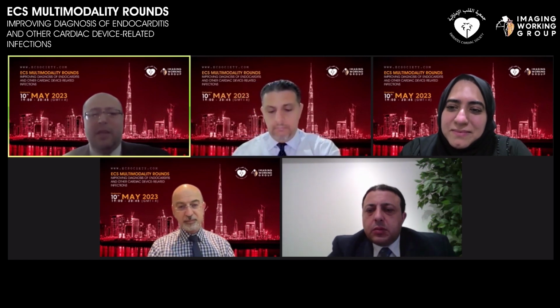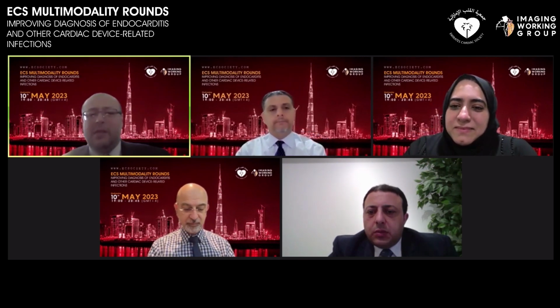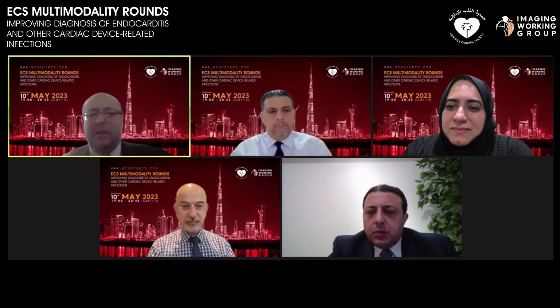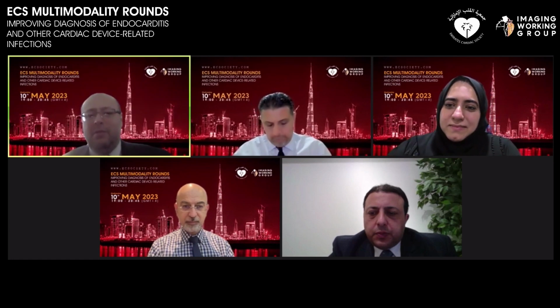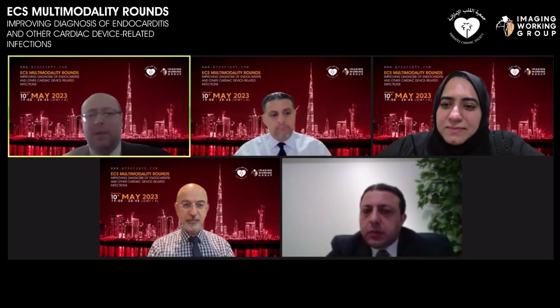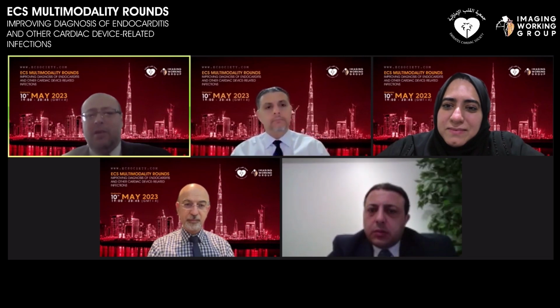If you're thinking of FDG PET, for the lead itself, I think we have good sensitivity now, especially with the newer PET scanners. And if you follow the preparation very well, you will be able to detect the lead infection. Obviously, unless it's very tiny, but the significant lead infections will usually be picked up very well by FDG PET. So the main concern is going to be what is your pretest likelihood.